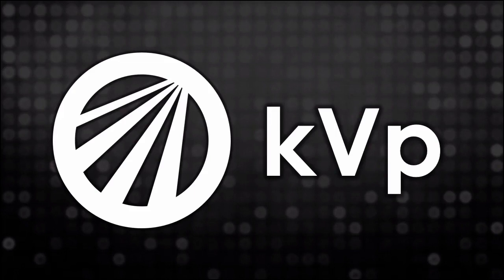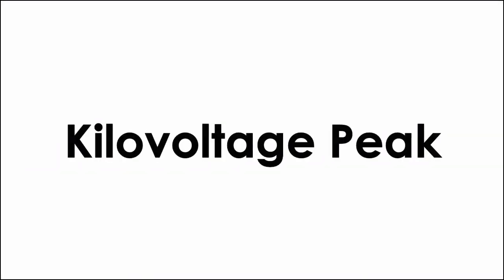Welcome back. This lesson is the third in a series about the prime exposure factors. Here we're going to be talking about the kVp. kVp is actually an acronym that stands for kilovoltage peak. The kVp is what accelerates electrons and forces them through the X-ray tube. So basically, here's what's happening.